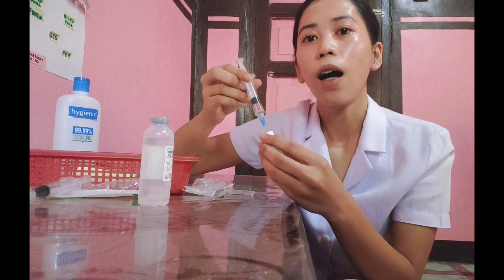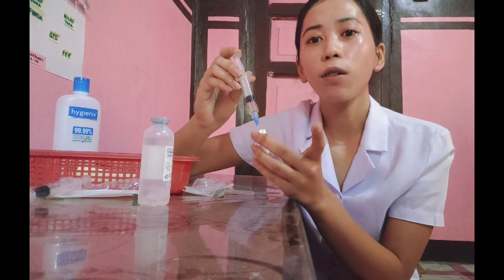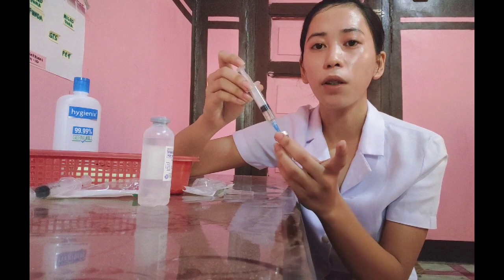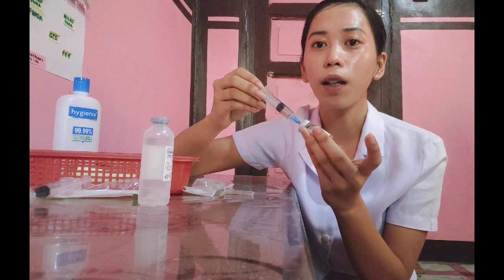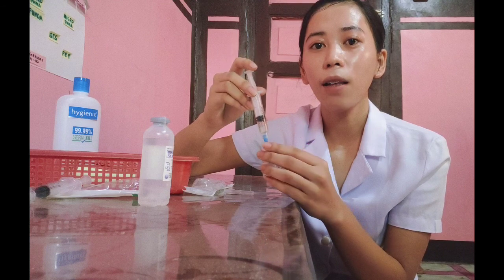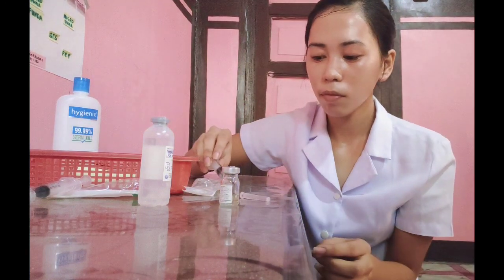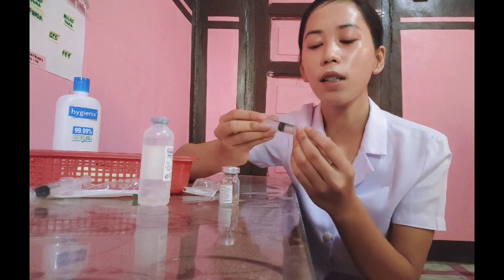And then eject the air remaining at the top of the syringe into the vial. And then when the correct dosage volume of the medication plus a little more is obtained. So let's add 0.25 ml. And then withdraw the needle from the vial and replace the cap over the needle using the scoop method, thus maintaining its sterility.